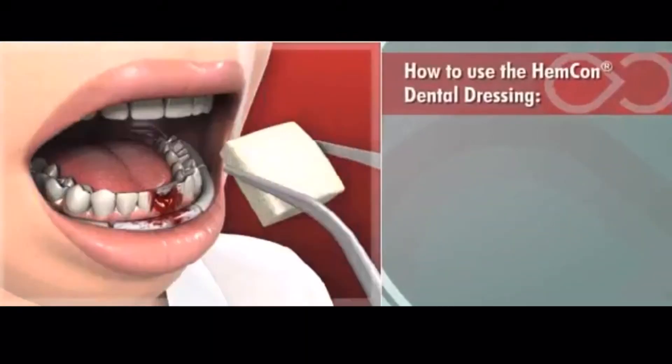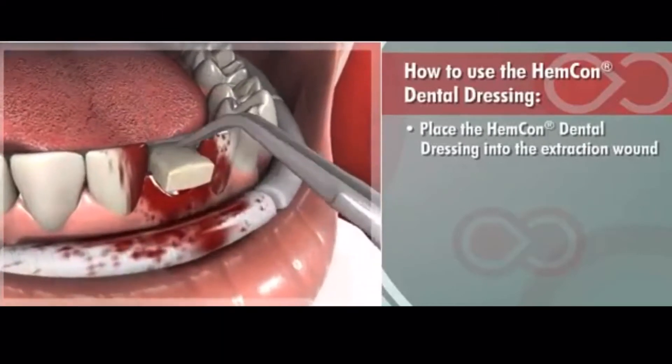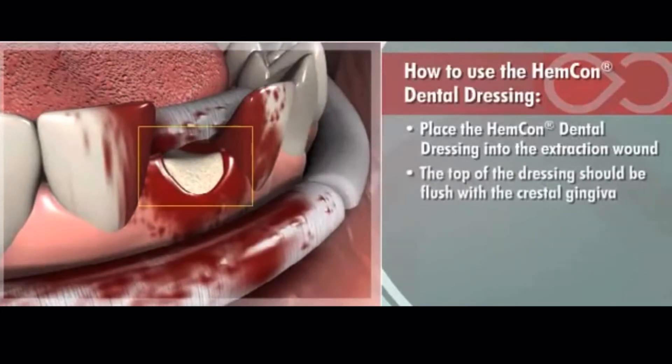Applying the Hemcon Dental Dressing requires only a few simple steps. Using cotton pliers, place the Hemcon Dental Dressing into the extraction wound, making sure it conforms properly to the socket. Once it conforms, the top of the dressing should be flush with the crestal gingiva.